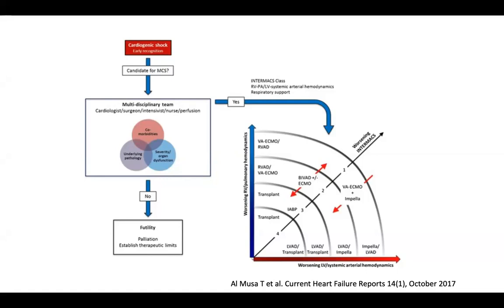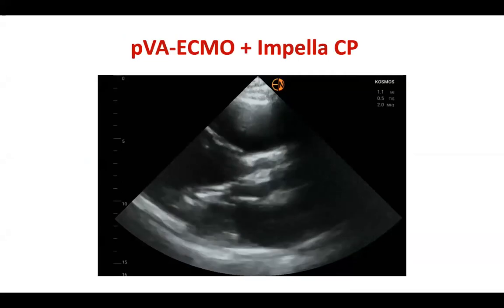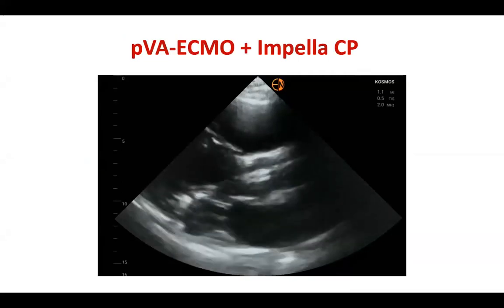to actually support the organ perfusion, but peripheral veno-arterial ECMO comes with the expense of increasing LV afterload, because the idea comes by offloading the right heart and returning a constant amount of non-pulsatile blood to the descending thoracic aorta. And this leads to a significant increase in afterload. And therefore, you often require an offloading strategy with peripheral VA ECMO.